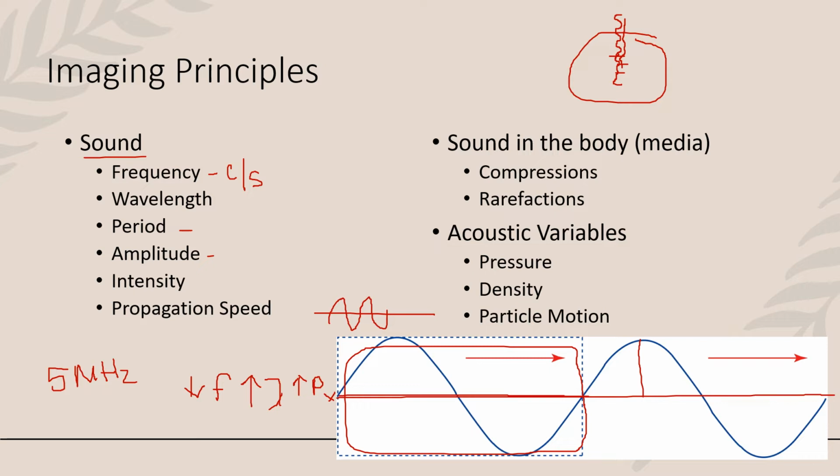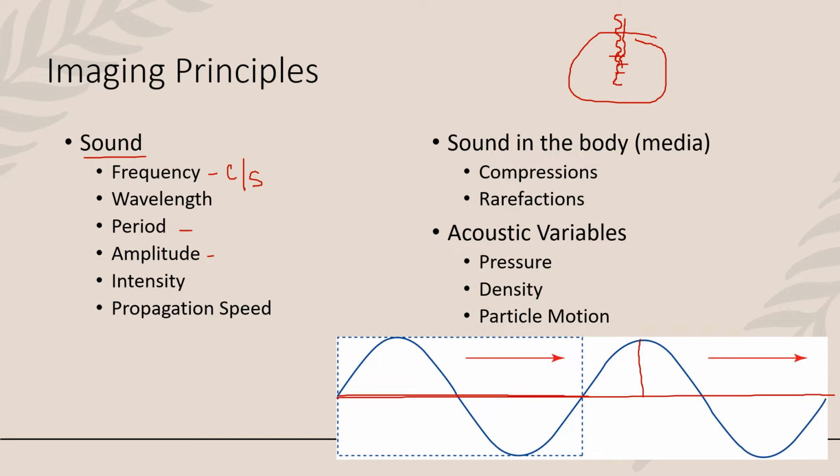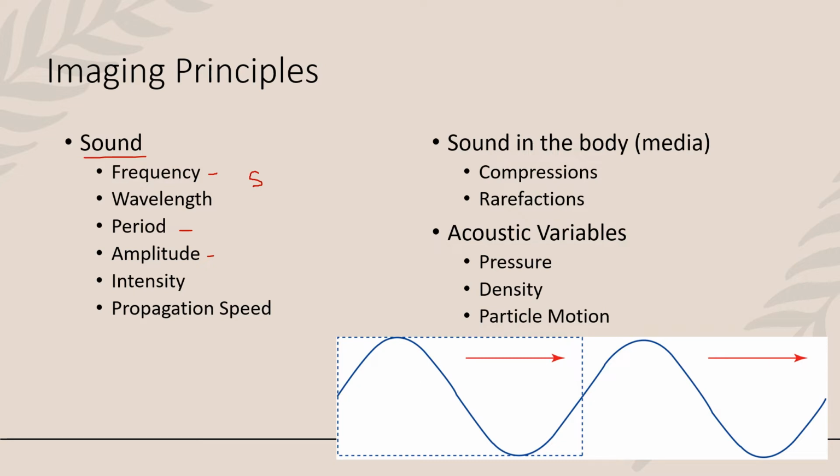If we look just one more step into these sound waves and apply it to how they operate within the body, it's important to understand that as the sound wave traverses through a patient's body, it's causing molecular or atomic motion within the patient. So as my sound wave goes through my patient's body, these areas of peak will cause the molecules of that patient to compress, and then as that wave moves through and deviates to the other direction, it will allow the molecules to then expand.